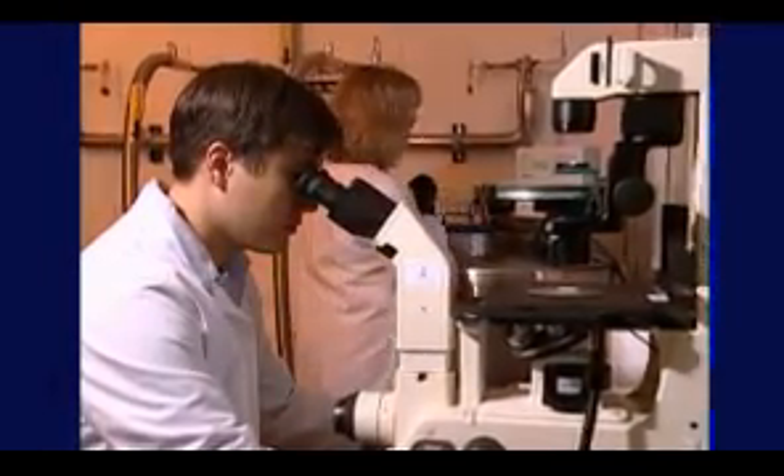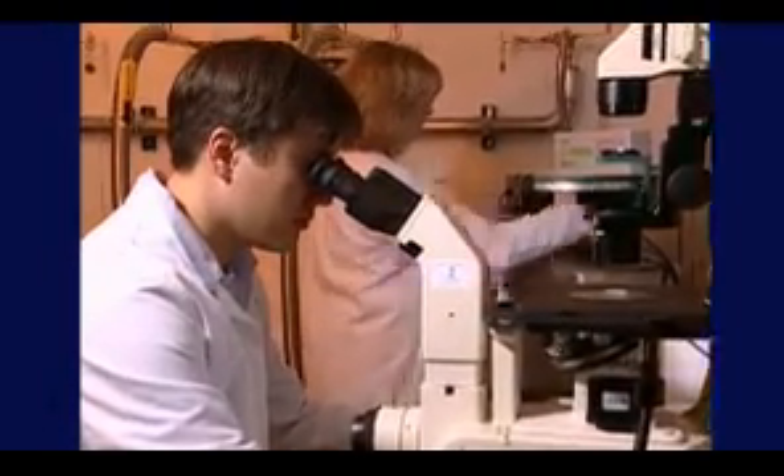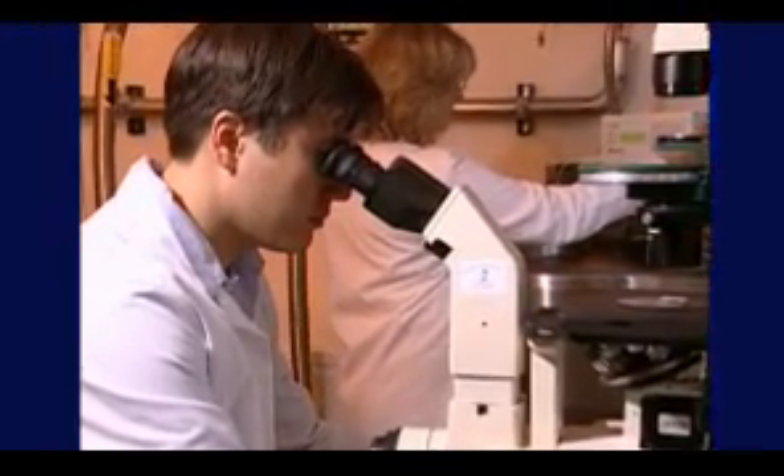The sperm bank laboratory staff analyzes the semen sample before freezing it. This is called semen analysis, and it's done to make sure that the sperm you're storing are healthy.